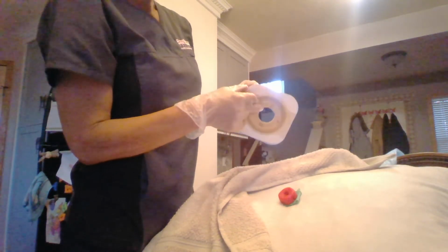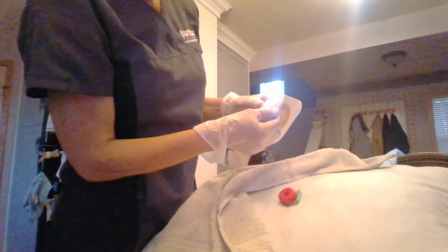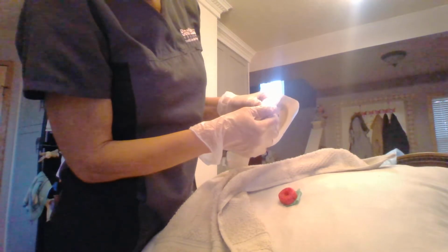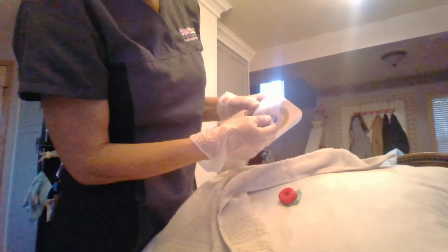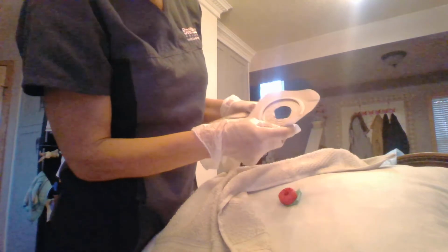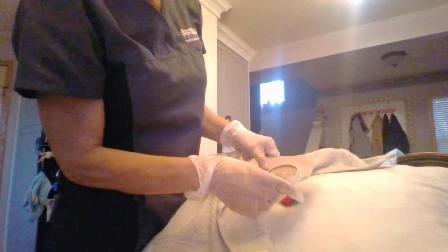Remove the backing. It's adhesive. It sticks to the skin, so once this is removed and pressed down for a couple minutes or whatever the procedure with the system instructions is, you would then remove this, dispose of it in the proper waste disposal, and follow with the procedure to seal this.